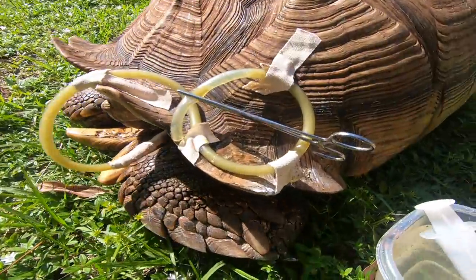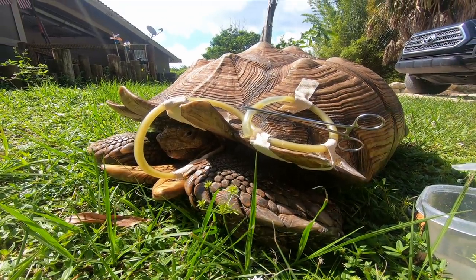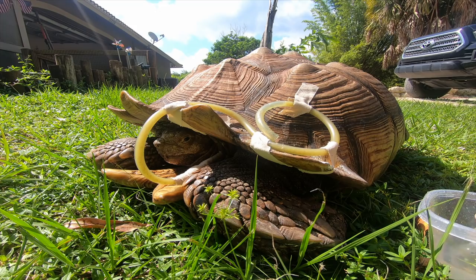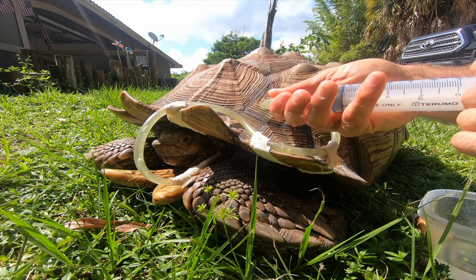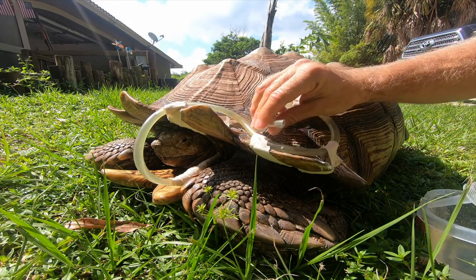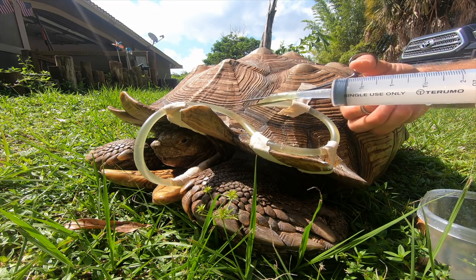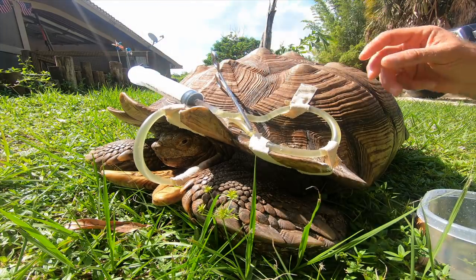But you can see how there's food in this tube. So we want to make sure that we've cleared the tube of the food. And that's what we're on about right now. So open that up. Just draw up some liquid. It's nice and warm for them. We just flush it through. You see how we're flushing through there? Let's do it again. About 120 mLs should do it. There we go. All right, now I'm going to go ahead and clamp him. Oh, there we go. That's Lumpy. I'll leave that right there for a moment.